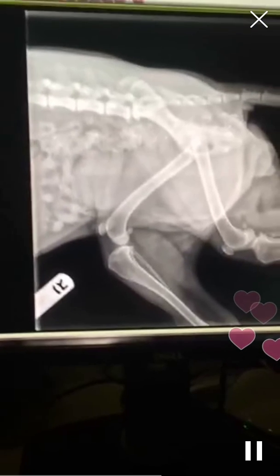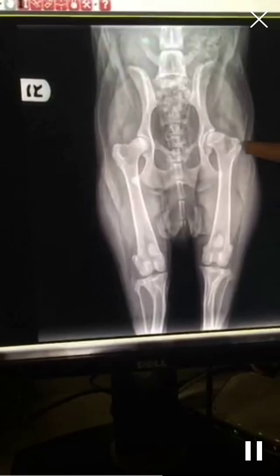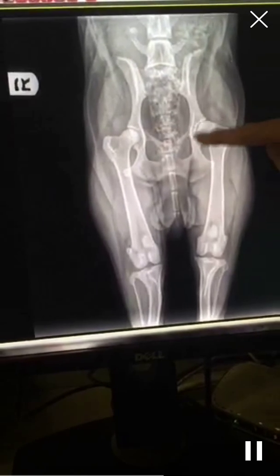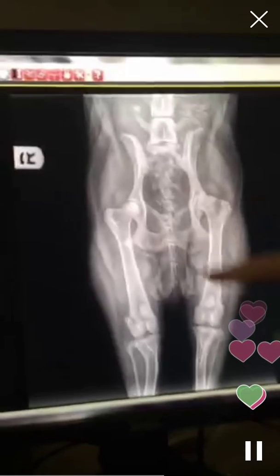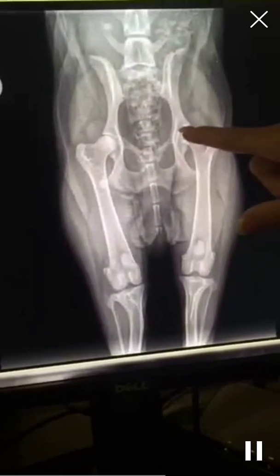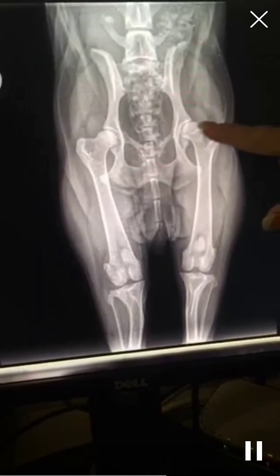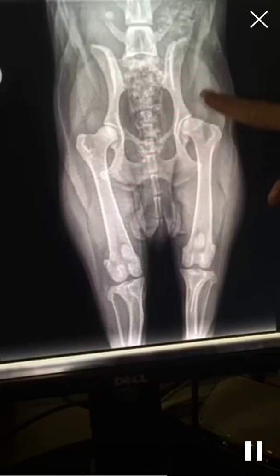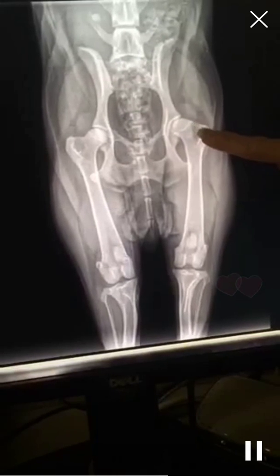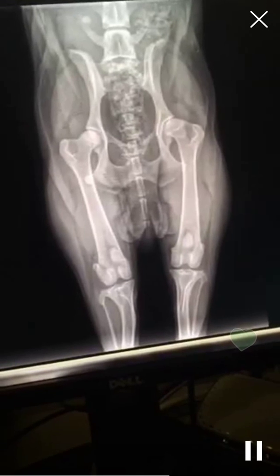I'm glad we took the x-rays. So we definitely have some dysplasia. When we look at the hips, we like to see this ball joint really deeply seated in the acetabulum, which is the cup. This hip conformation is much better on the right side than the left side. This should be down here, more centered in the joint, and it's luxated up a little bit. We call this a subluxation. So it's not luxated out of the joint, but it's rotated, and it also is flattened here. That's not a severe sign of dysplasia. It's more of a mild sign of dysplasia.